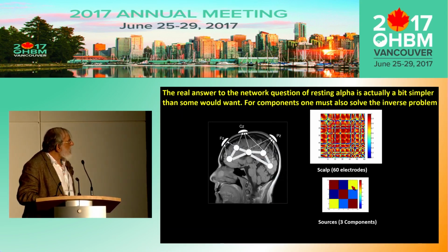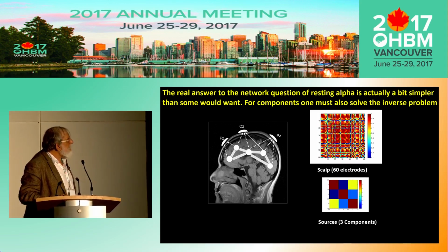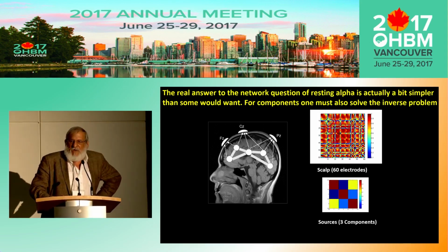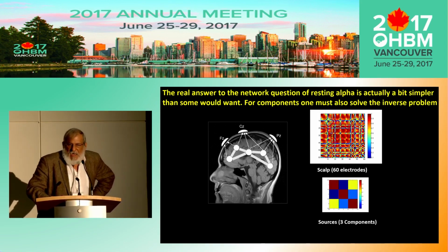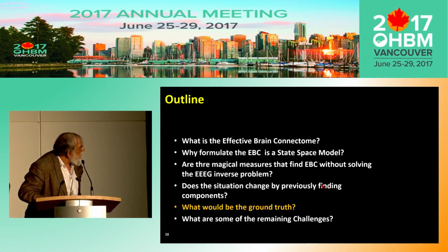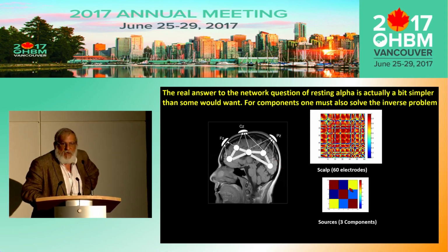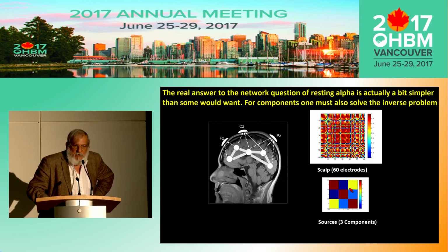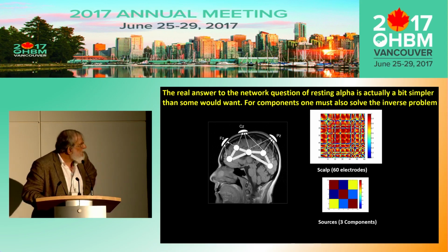And the point I want to make here is, here's the data I was showing you at the beginning of the talk. This is the stuff that my students had fun passing through all these hub programs and graph theory. And actually, the explanation is really very simple. There's an alternative explanation from our analysis that there's just 3 little sources here that don't have a complicated structure. So once again, when you're dealing with EEG or MEG, beware of ignoring the lead field, because it can introduce entertaining but totally useless information.